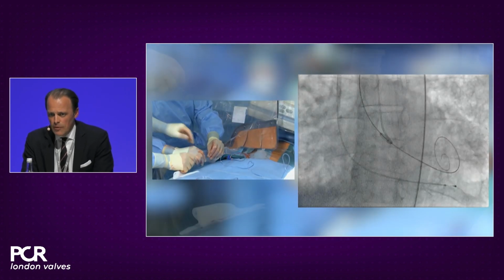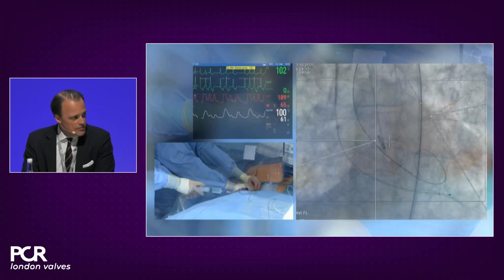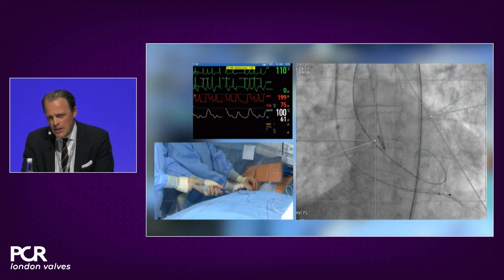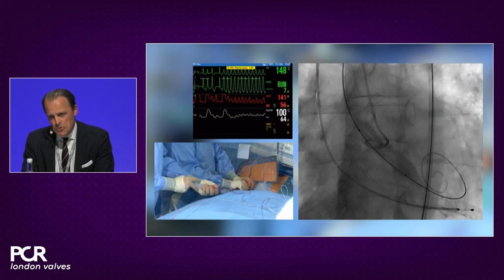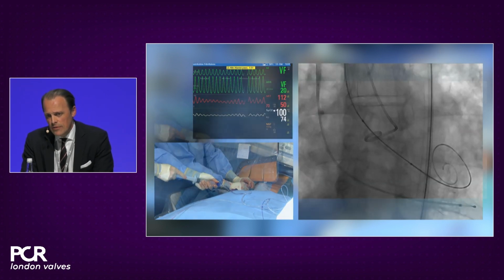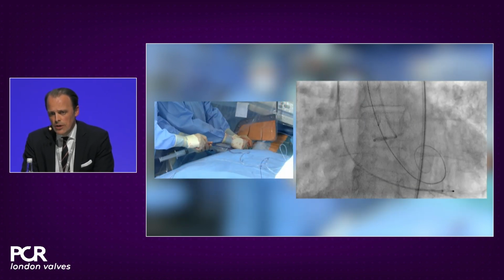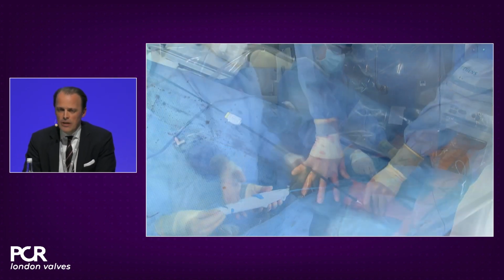This is being done with a dedicated TAVR stiff wire, and since this is an inline sheath, we need a 14 French in order to pre-dilate these valves. I like to pre-dilate most of the valves that I follow up with the Navitor in a brief phase of rapid pacing, which is usually very well tolerated by patients.